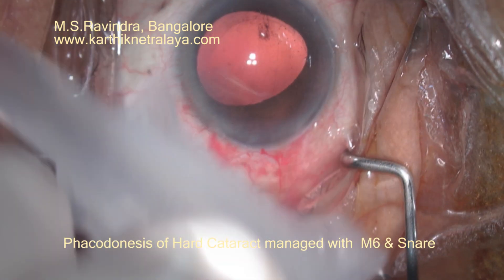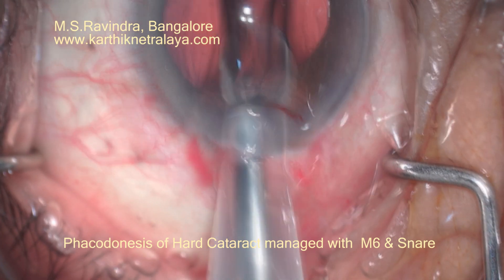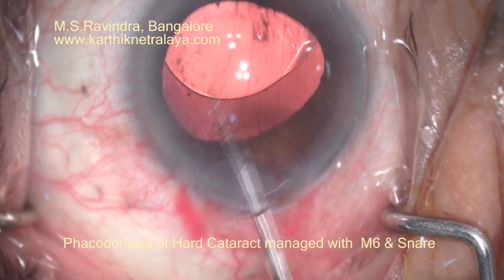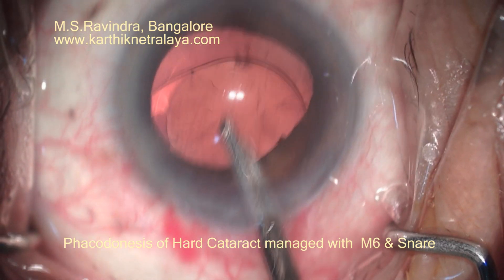The cortex is aspirated and that is the end of the surgery. In spite of the phacodonesis, weak zonules, and the capsular bag compromise, it was possible to do the cataract extraction in this very large nucleus cataract uneventfully. Thank you.